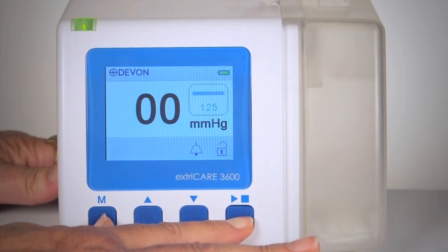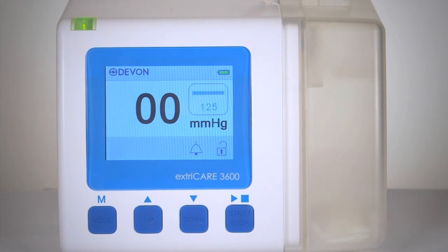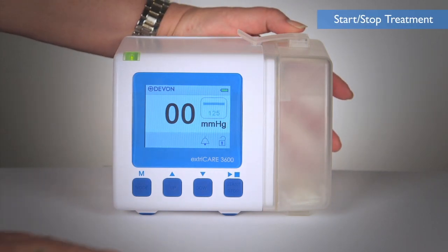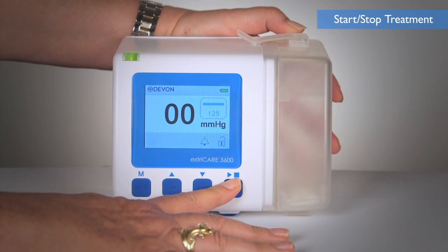If an alarm sounds when the device is locked, the backlight to the screen will turn on and the alarm will display. To start or stop treatment, press the start-stop button for 2 seconds.